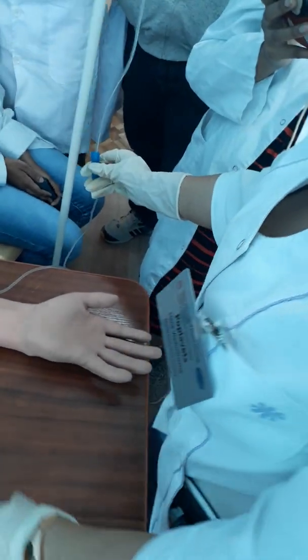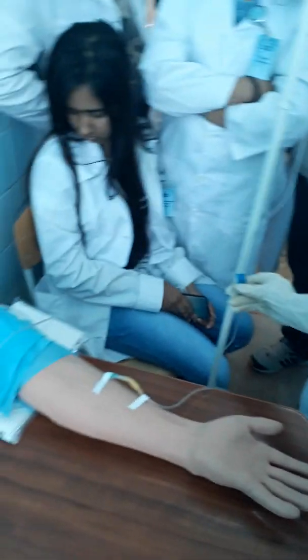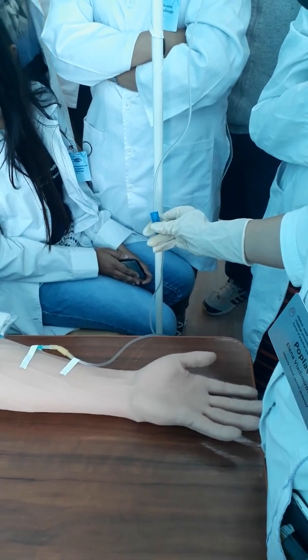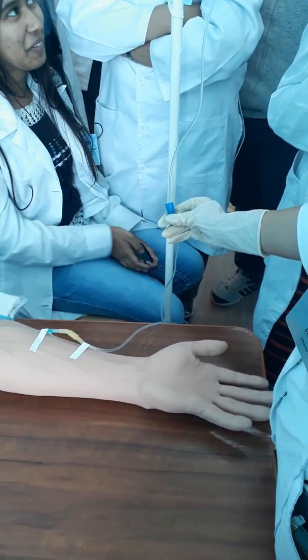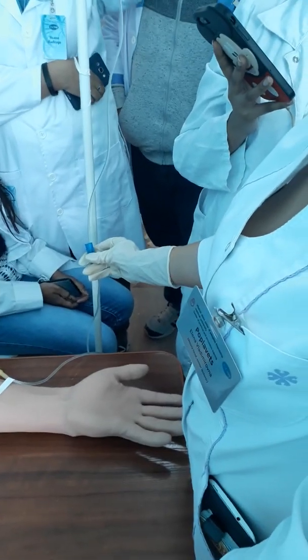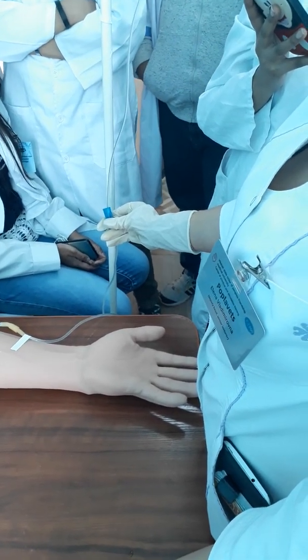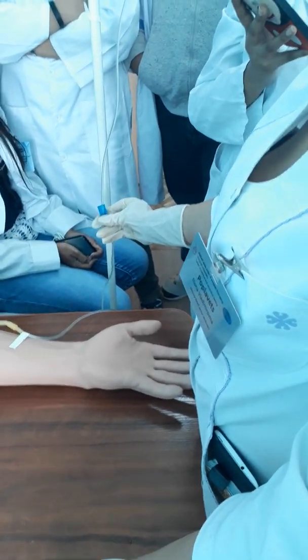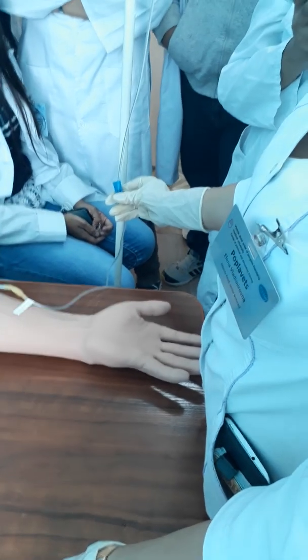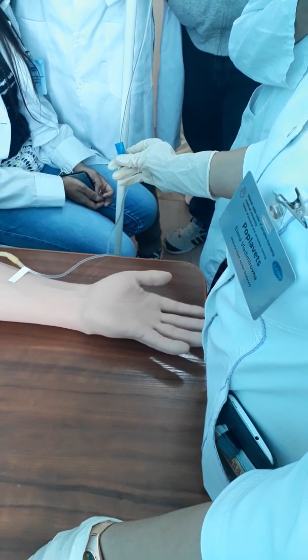For example, you can read this information in your patient's administration record list. Your patient needs the solution administered at 15 drops per minute. How will you count it? 15 drops per minute. It's 1 drop in 4 seconds. You check: 1, 2, 3, 4 drops. 1, 2, 3 drops.